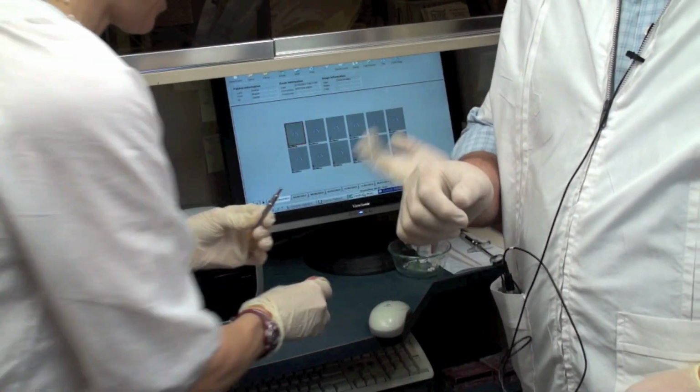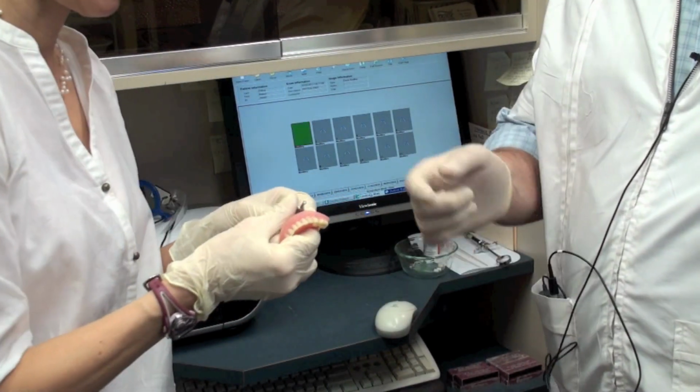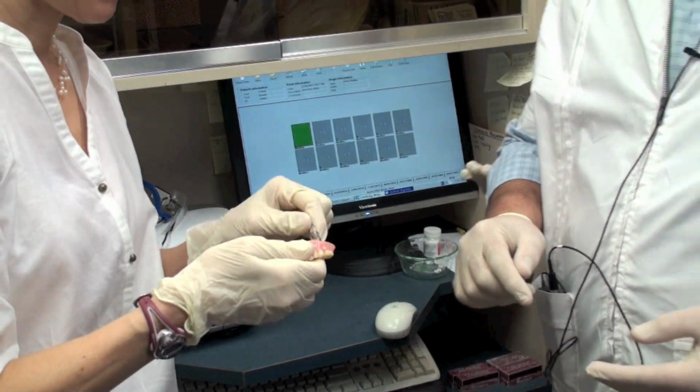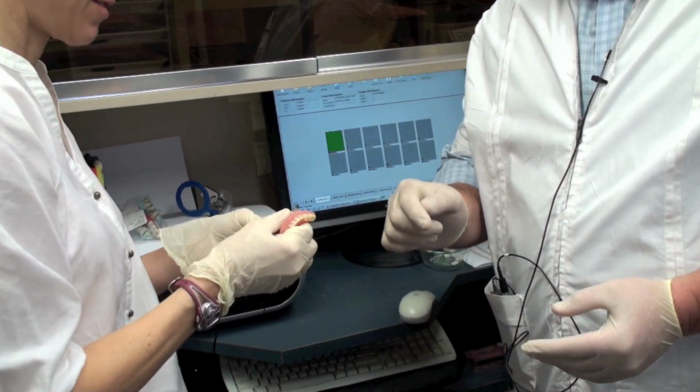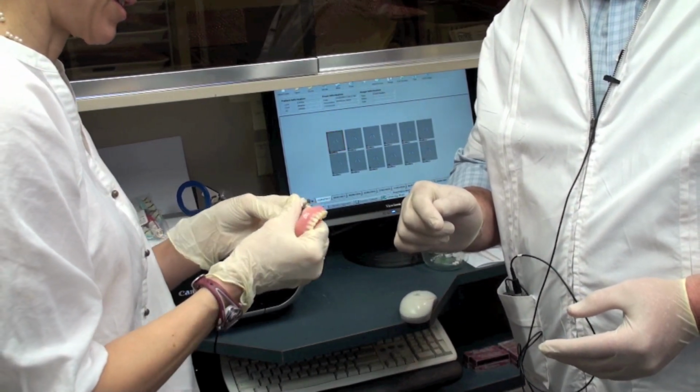Okay. Yes. Can I try one more? Yeah, and then we'll get you to try it on. Should I wash my hands? Yeah, you can put some gloves on. Oh, that's good, because I haven't taken that out of the package yet.